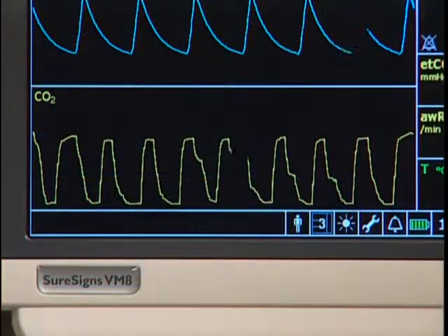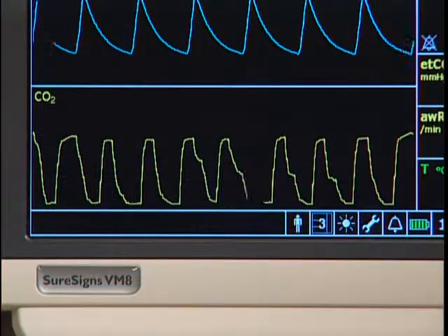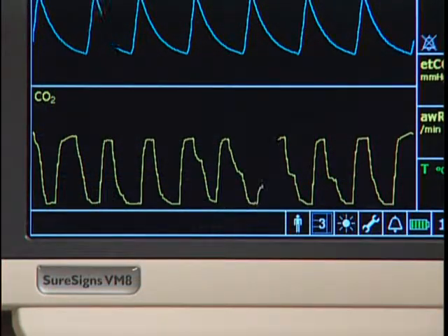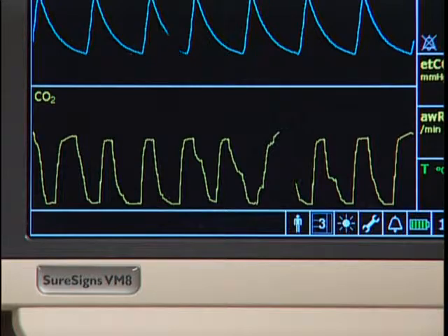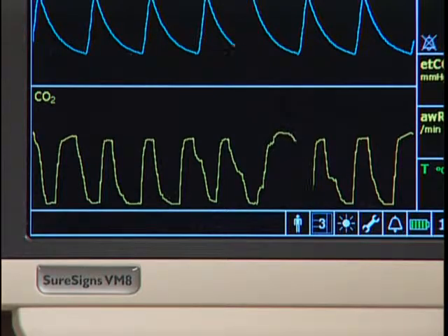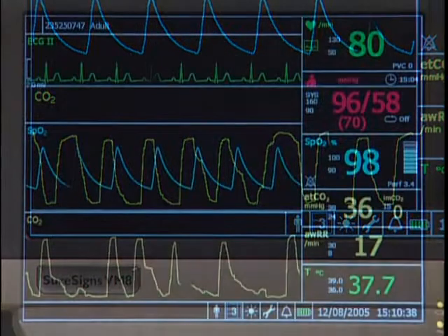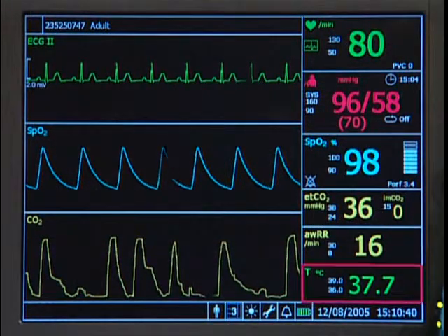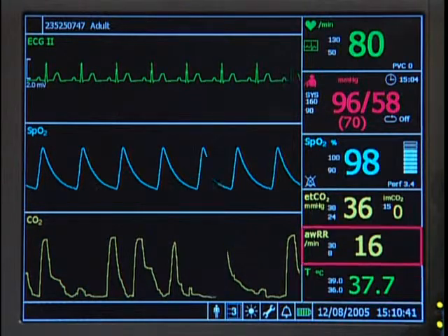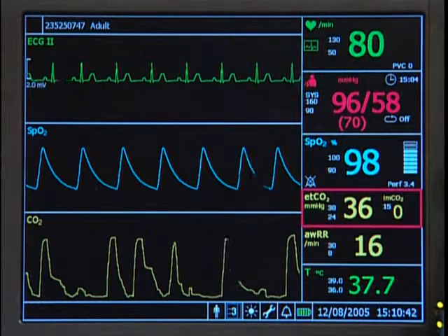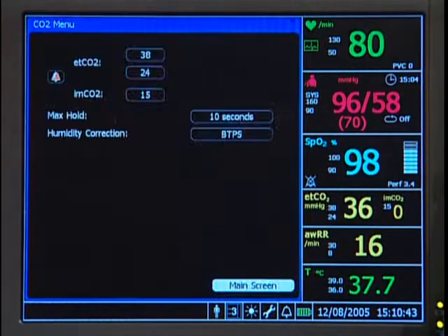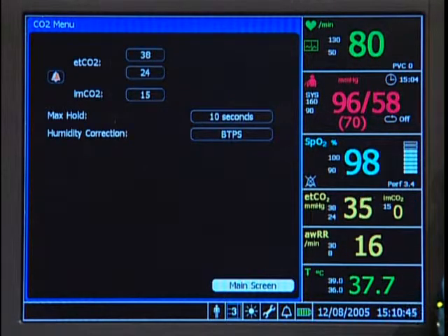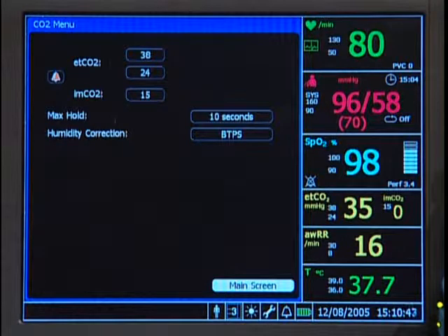In addition to the numerics, the monitor also displays the CO2 waveform, or capnogram. Highlight and select the ETCO2 pane to make changes to alarm limits for ETCO2 and IMCO2 and other settings.